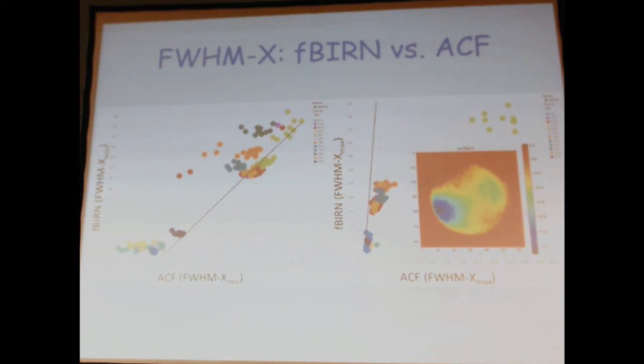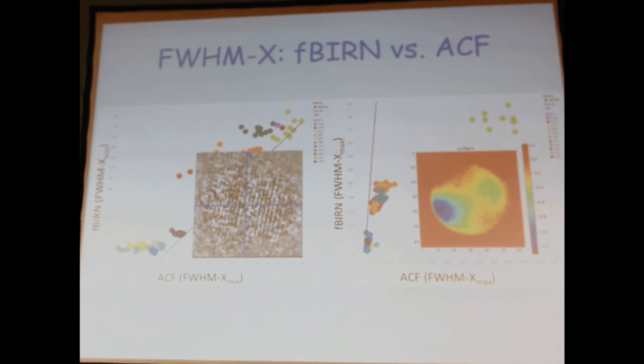That one we've already talked about. It's actually one of the green dots up at the top. This one we only discovered a couple of weeks ago. All these guys here that are very low are these high-frequency spatial striping patterns. This is actually from a nominally well-behaving Siemens scanner, our own at Baycrest. So we're now trying to work out how often that happens and whether it's a big deal. We now have both low-frequency non-uniformity and high-frequency spatial non-uniformity effects which show up in resolution measures, particularly per slice.